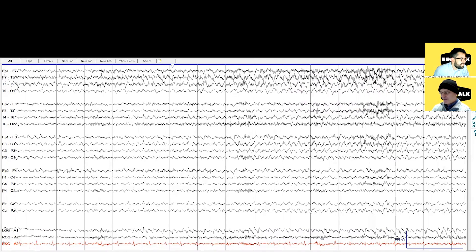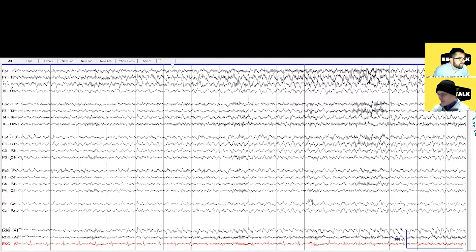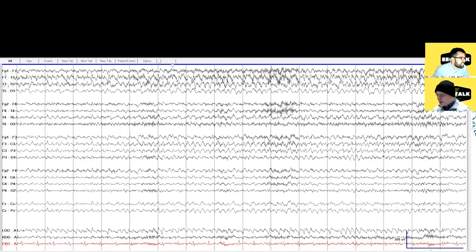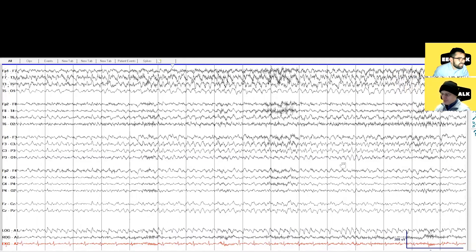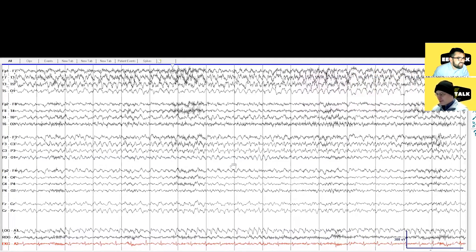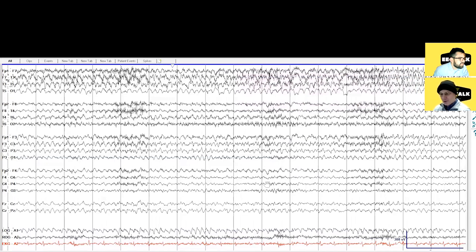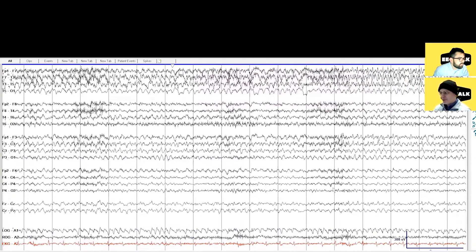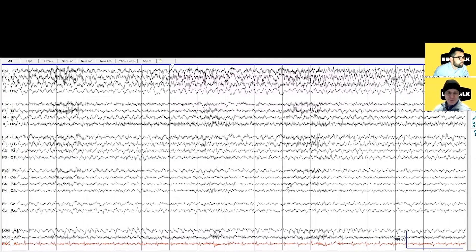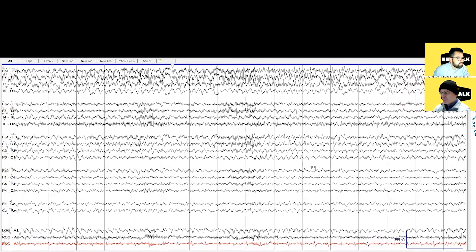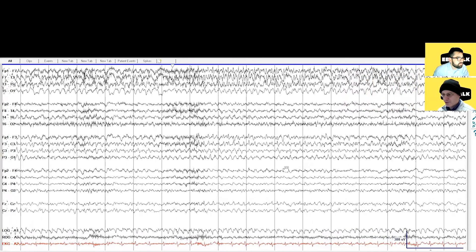I'm letting you drive this time, but I think we're going to keep you in shotgun more often. It's mostly on the left. The right is no longer normal — I'm wondering if some of this is maybe volume conduction, because it's pretty blunt-looking on the right compared to the left. So this is probably — what did the patient actually do? It looks like there was no convulsion per se, but what did they do clinically while all this was going on?